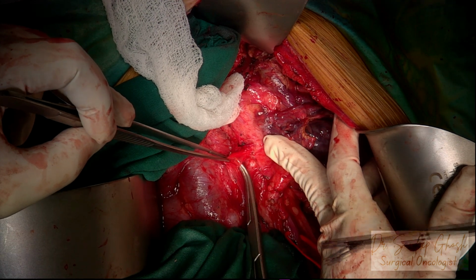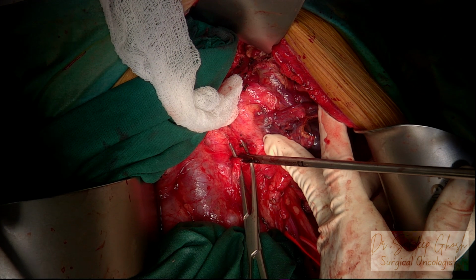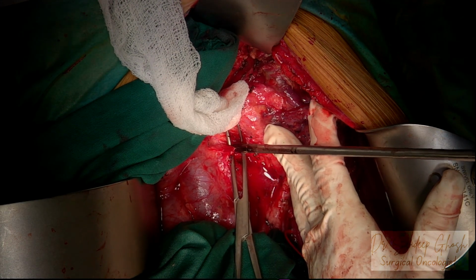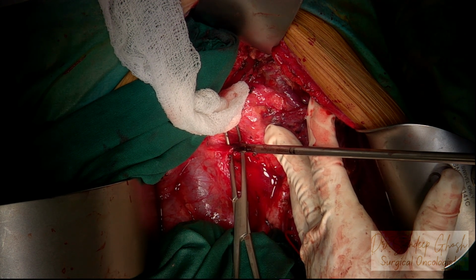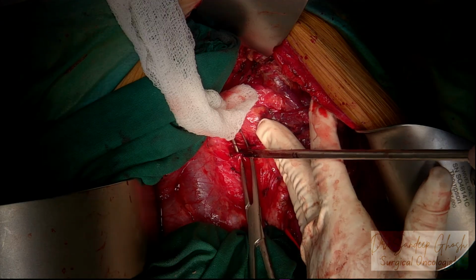Now we are working at the paraaortic area. We are going from caudal to cranial direction, creating some space between the aorta and the tumor.